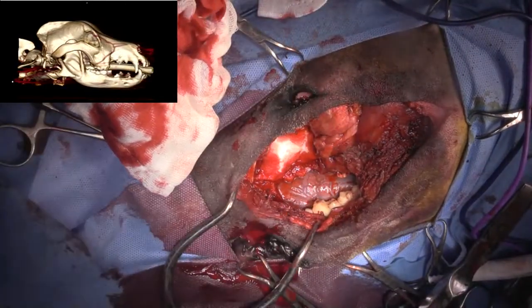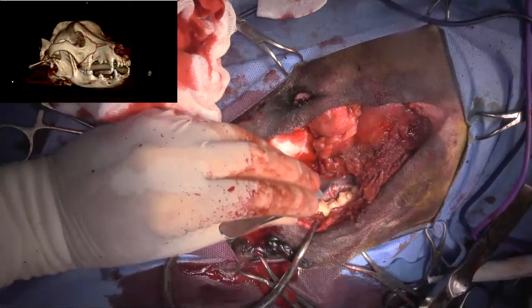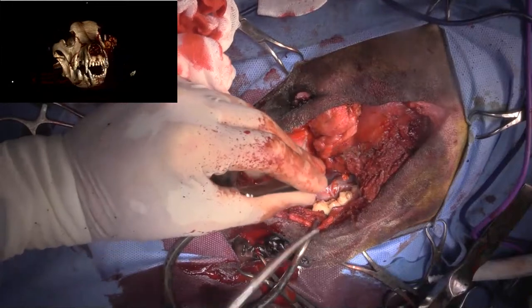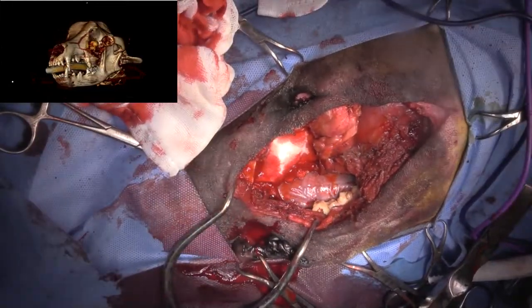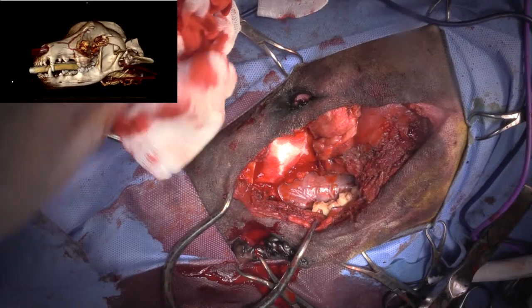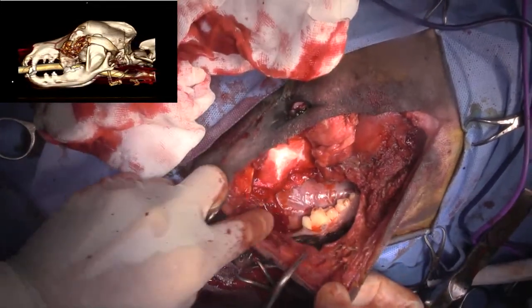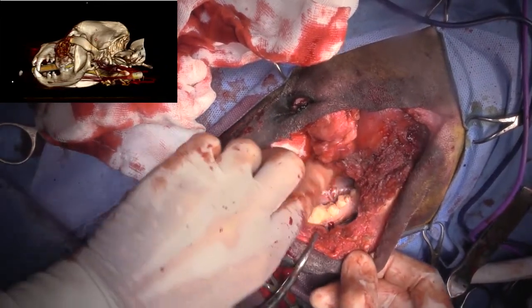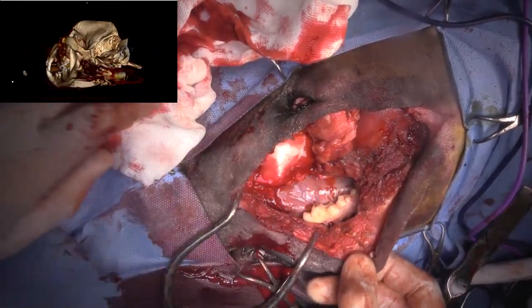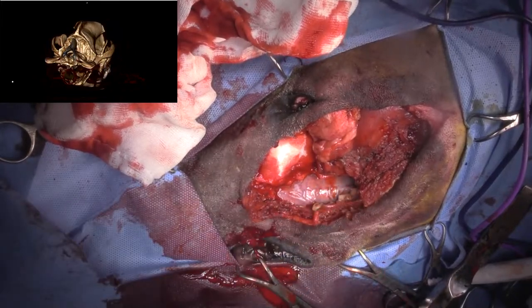Question: if the dog's breathing will be affected at all? Should not be affected. It'll have a congested nose for a little while, but that's it. It's quite lateral. Yeah, we've only affected probably about 25% of the width of the nasal cavity. All right, so. Can I get some OPDS, please?